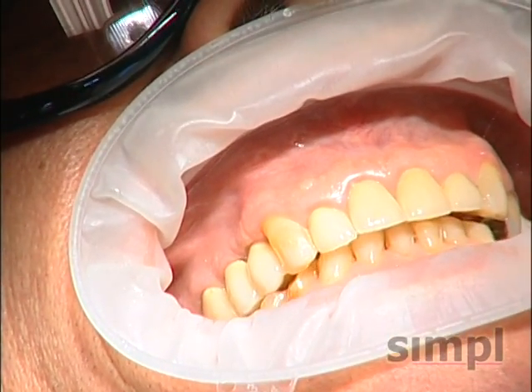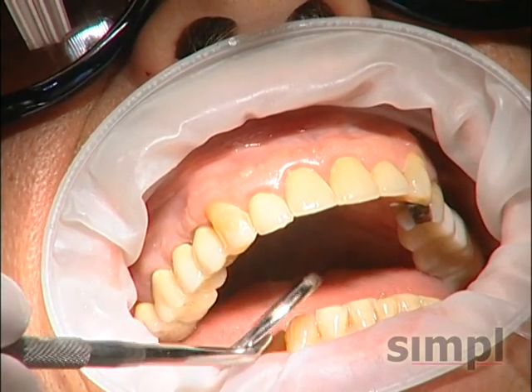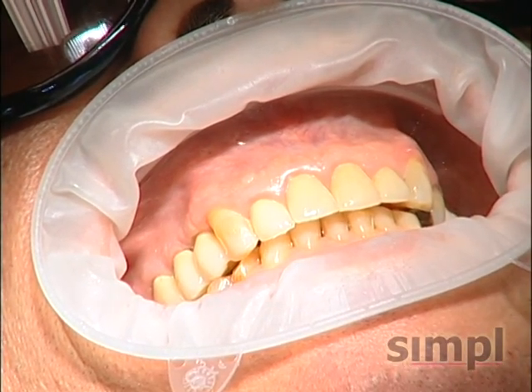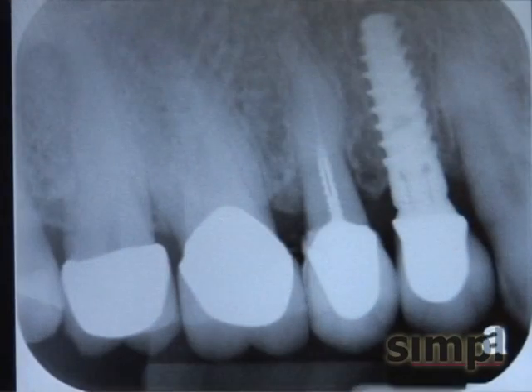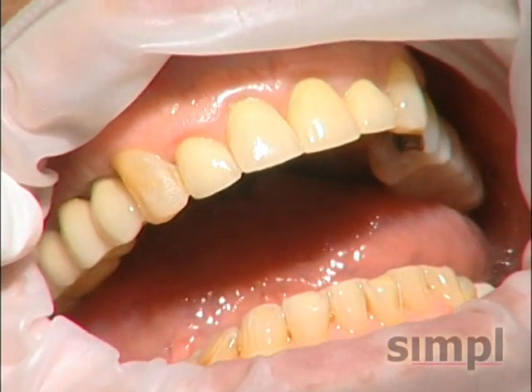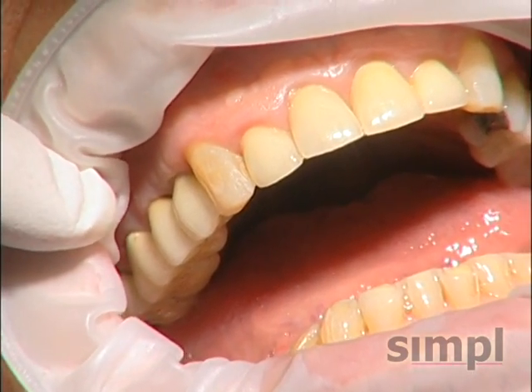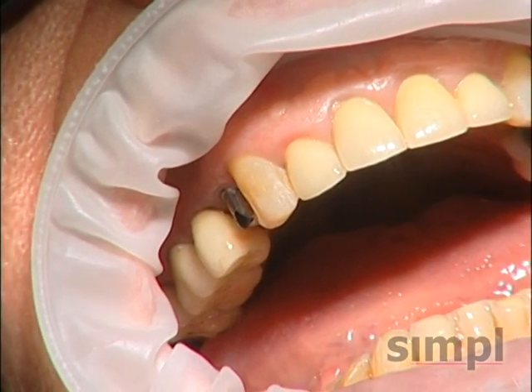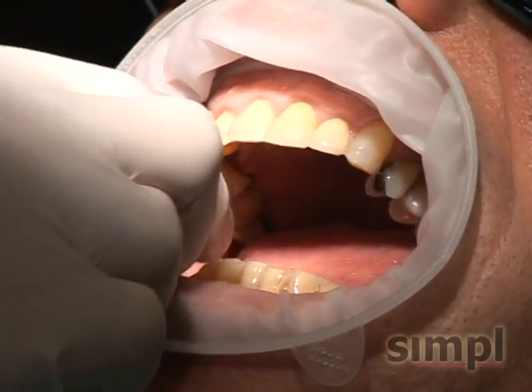Now, at this point, if the restoration doesn't seem like it's seating, we have the option of taking an x-ray to make sure it's seated in place before we cement it finally. So why don't we go ahead and take an x-ray? So the crown appears to be fitting very well. I'm just going to touch the occlusion a little bit before we cement it in. So slightly. And then we'll do a final check after the cement sets.